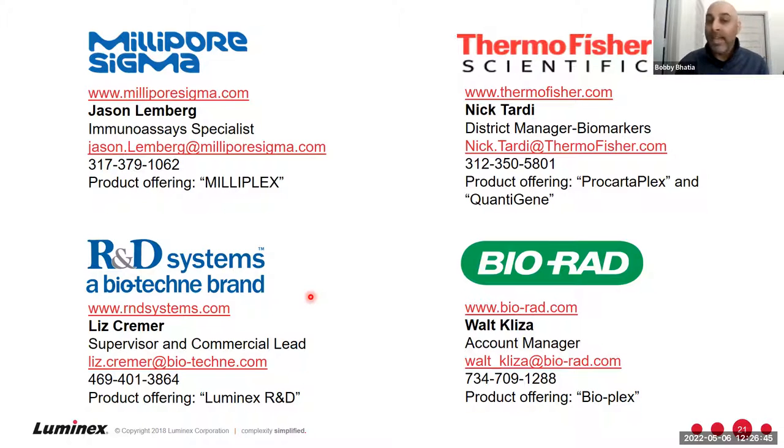I do not recommend to anybody who is in a project and committed to a company's kit that you change kits mid-project and then start getting results. You will find some problems as you try to make a comparison between kits mid-project. So I would say, try a kit before starting and committing to a project.